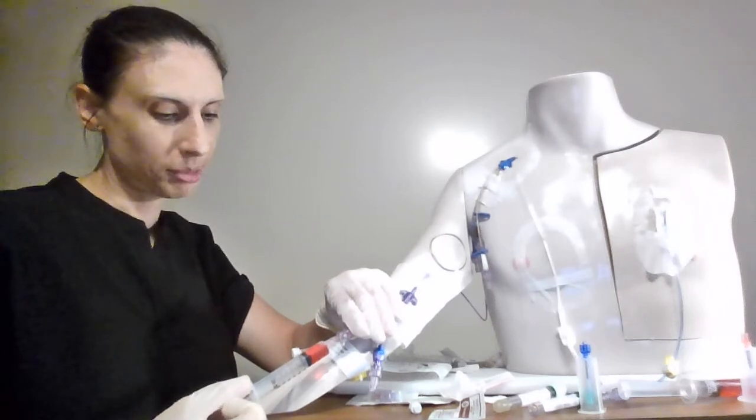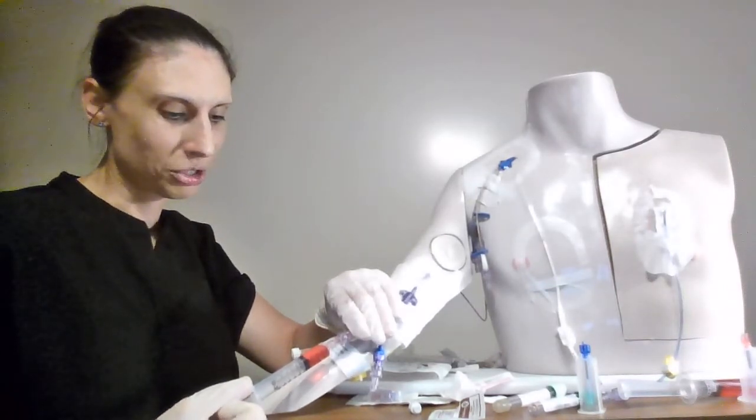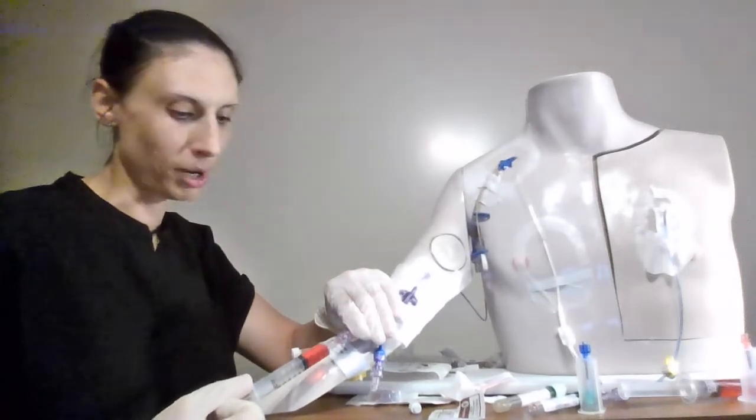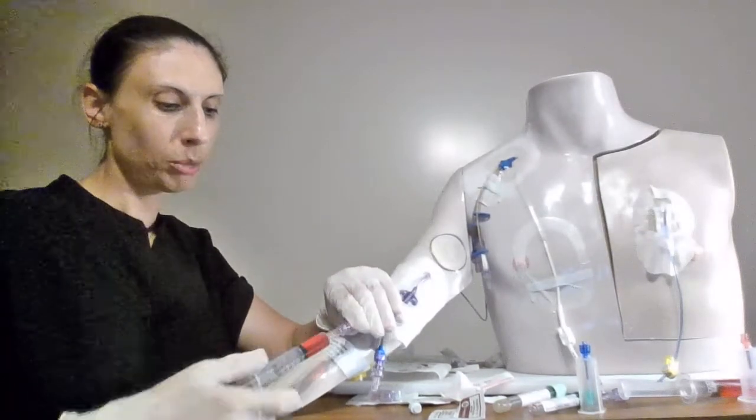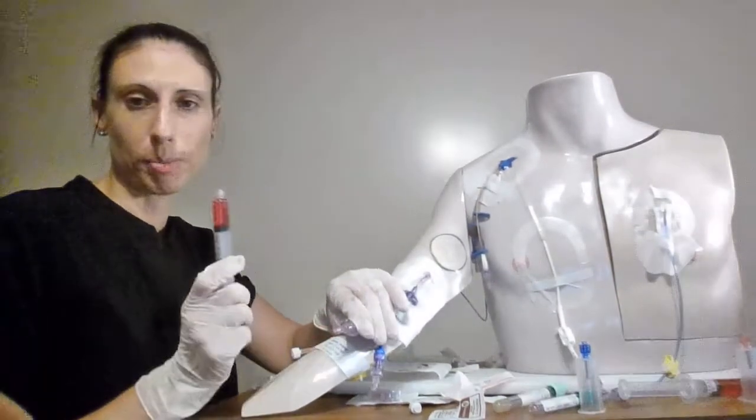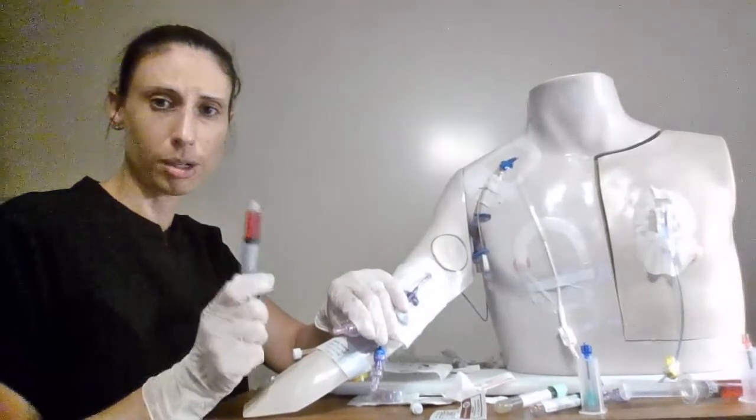So I'm going to say because this is taking me a while that I'm only going to be sending one tube off. So I need about 4 mLs. And what I'm pulling now is straight patient blood. So this is ideal blood for sampling.